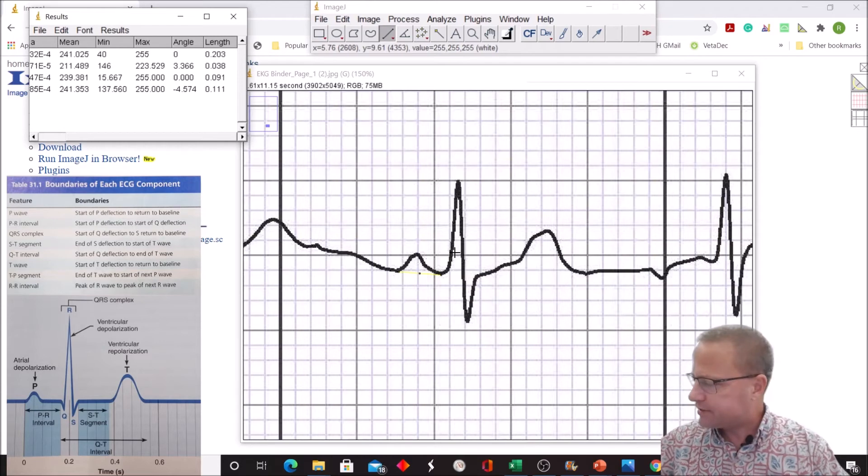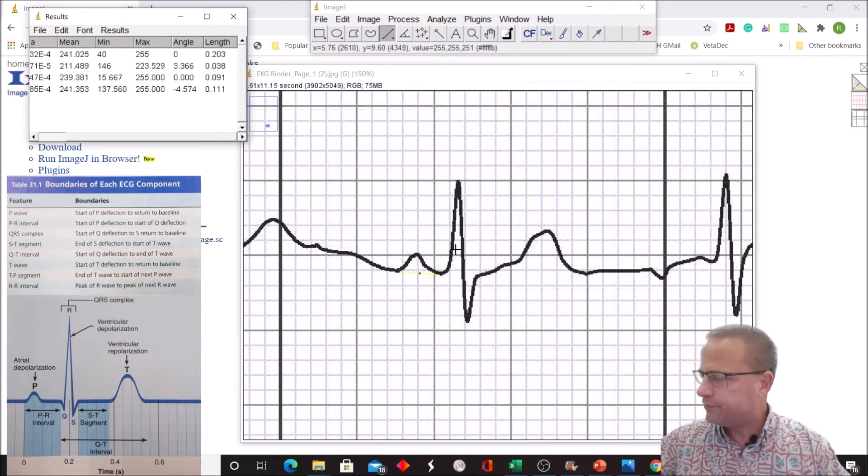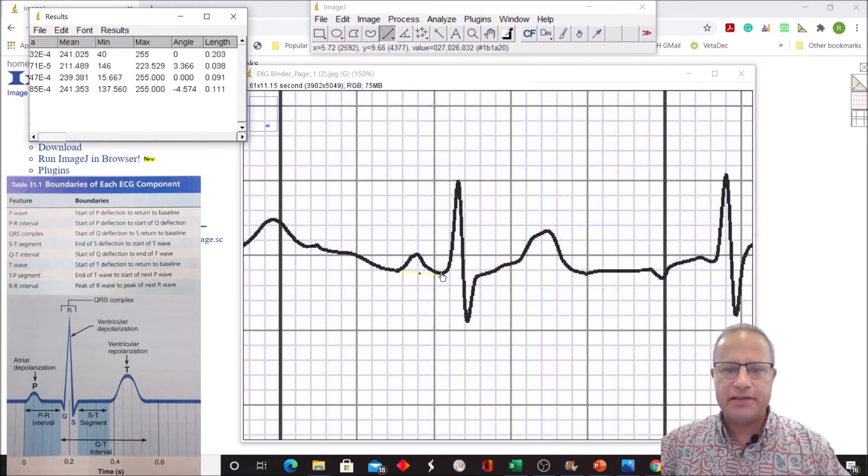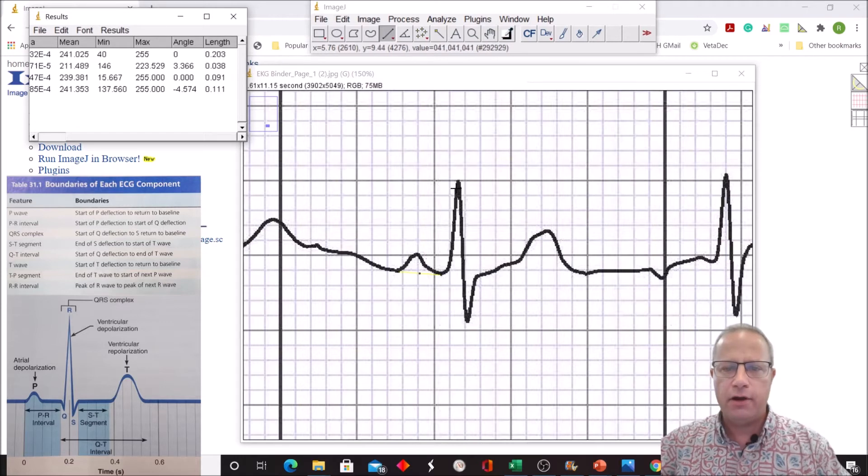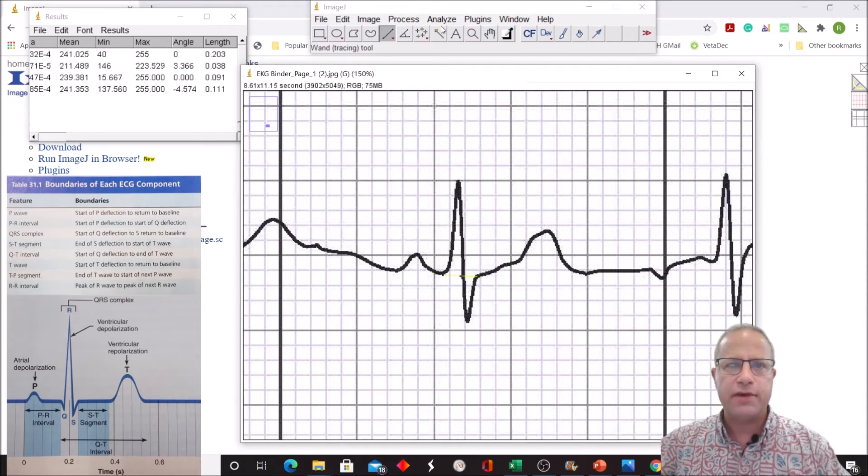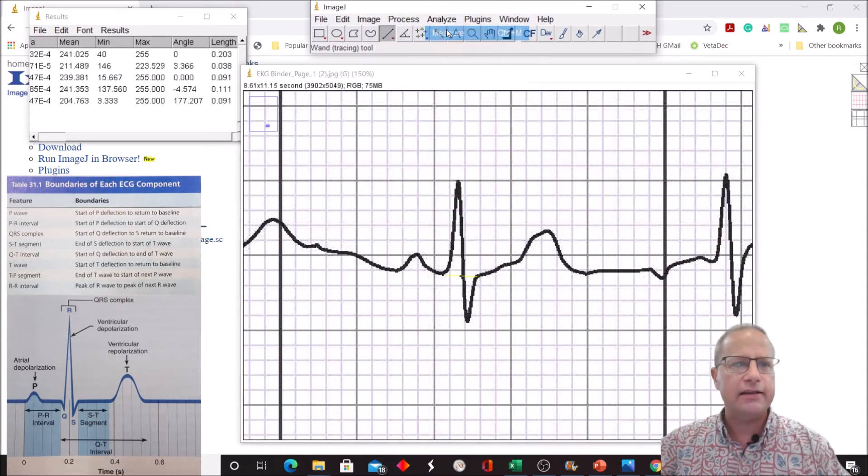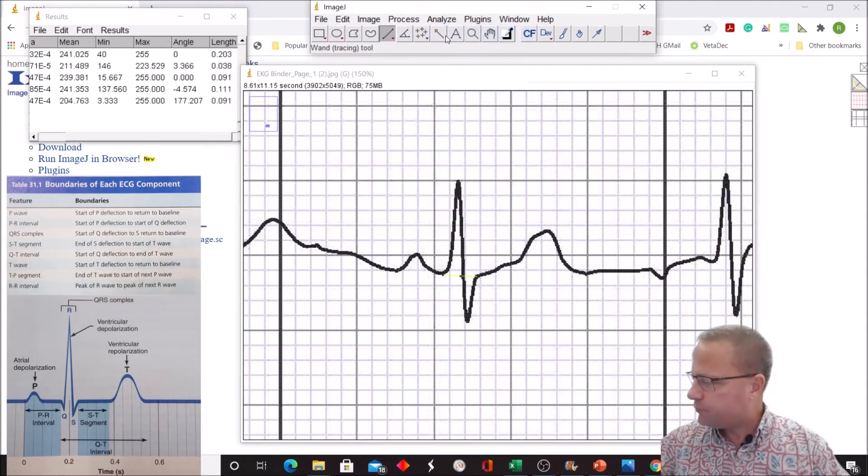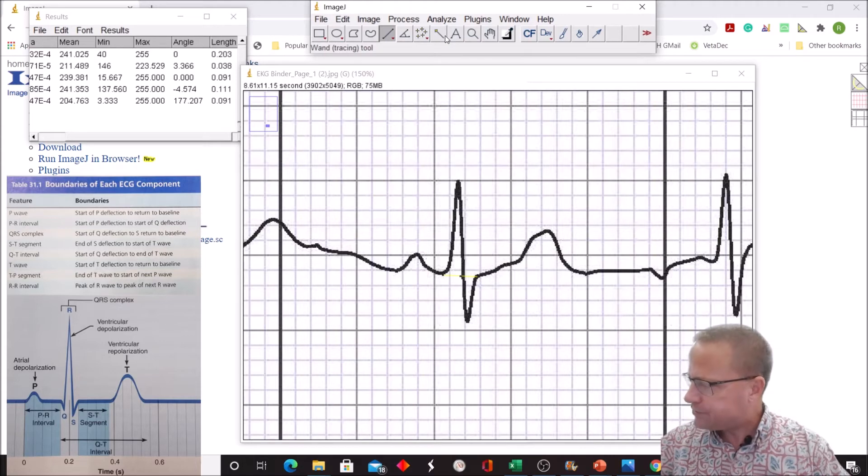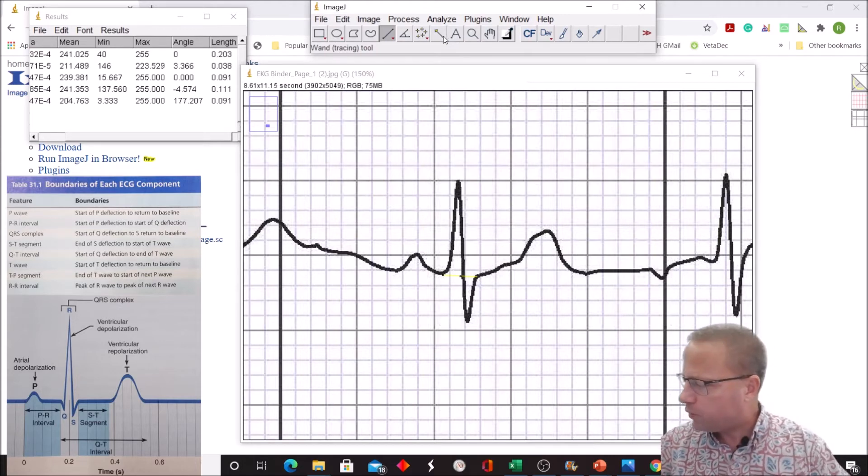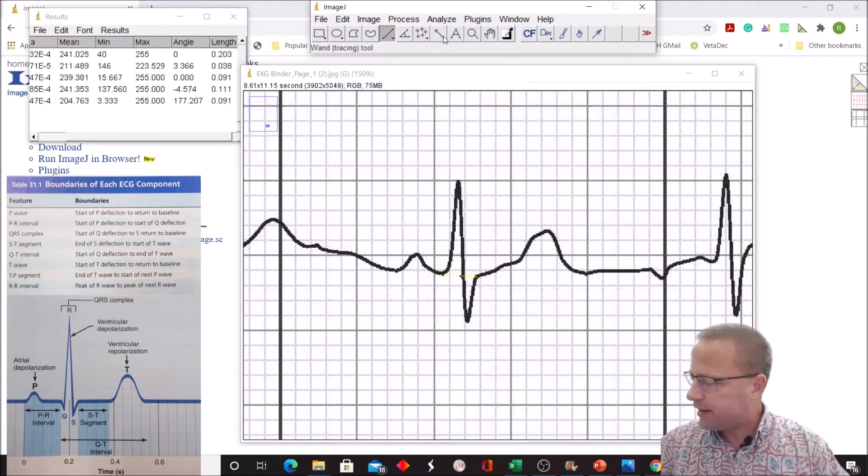Now let's look at the QRS complex. Start of Q-deflection to the S return to baseline, so this was Q, R, S, and this is baseline. We're going to go from the S to where I think the Q-deflection would start, right about there. Analyze, measure, 0.091. It's usually somewhere between 0.06 and 0.12, so that's fine.